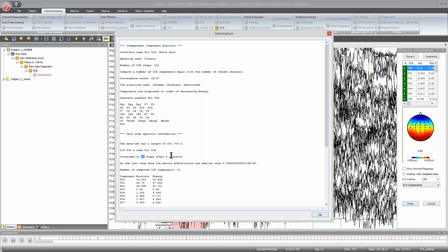And also for both numbers actually, there is not really a hard criterion when this would not be good. So usually if the number of restarts is around 10 plus minus 2, 3, 4, this should usually be fine.